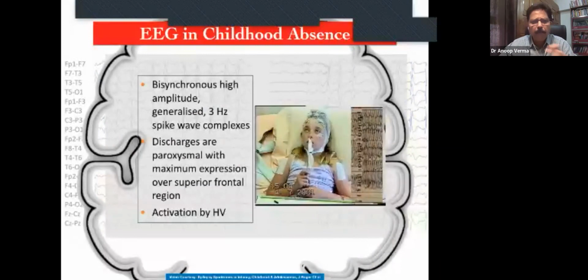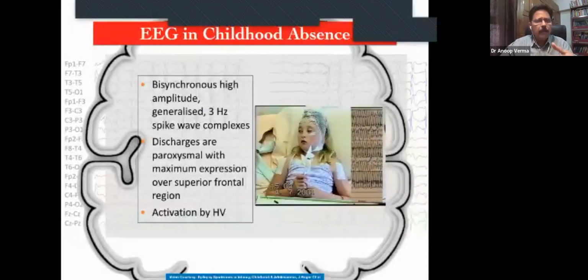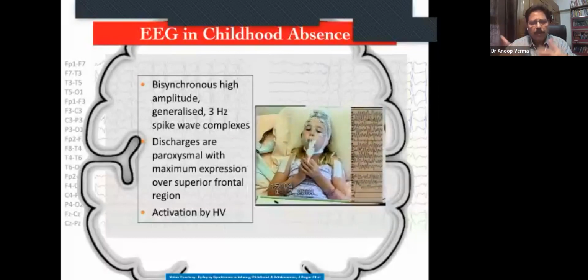And this is again a video of childhood absence epilepsy. You are seeing attacks of absence, and you are seeing the discharges which are mainly from the frontal region.